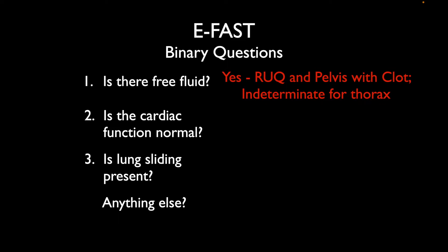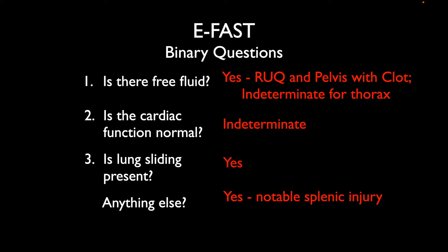Is there free fluid? Yes — we have free fluid in the right upper quadrant and in the pelvis, and there's clot forming that we can see. It's a little hard to say for the thorax and pericardial views, given that a parasternal long axis was attempted with a convex probe. Cardiac function was indeterminate due to that limitation. Lung sliding was present. And this is an interesting case in that there's actually a splenic injury that we can identify as we go through the images.